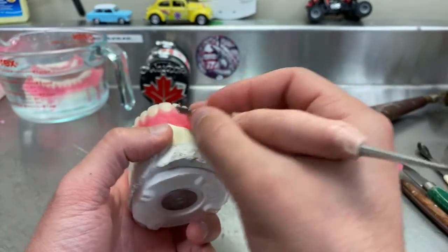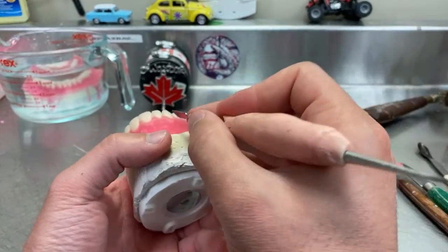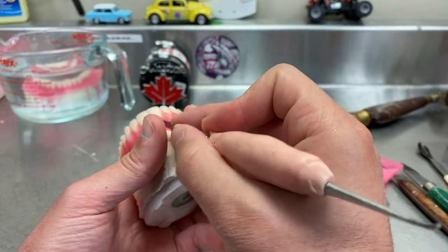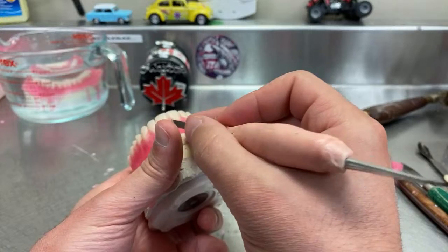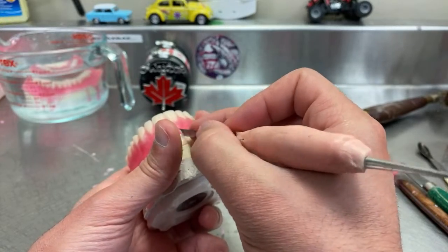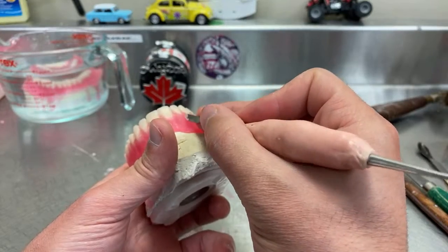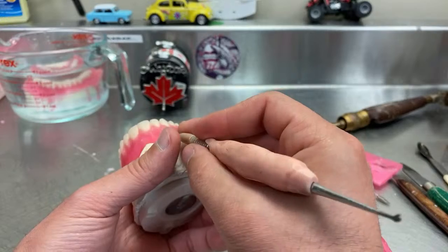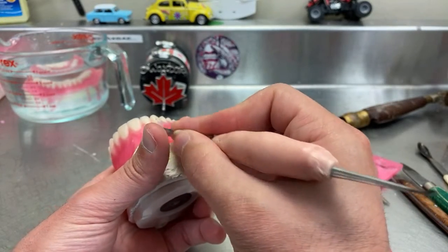But another thing is, do not make the roots so obvious. That's one of the things that I notice a lot of people do. They make the roots, it's just like a bulge right here. It's not always like that. And then when you come to the canine, make it a little bit, but not excessive again.